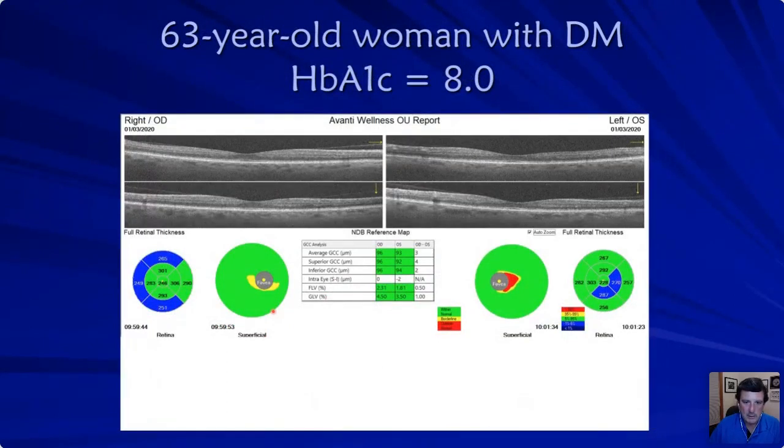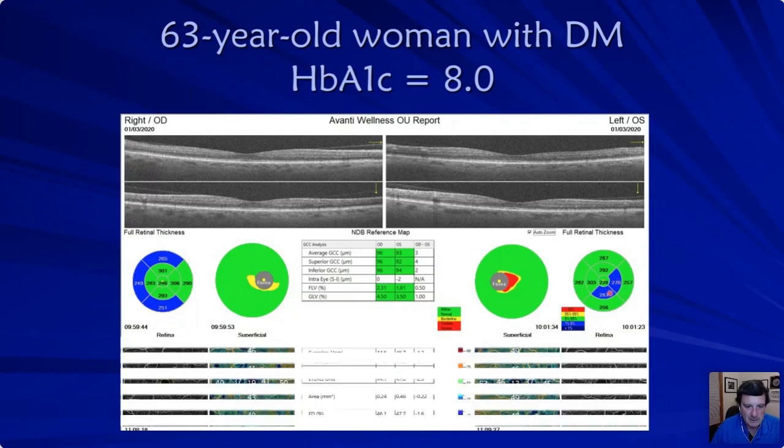And what we want to look at again is start here. Everything looks normal, nice and symmetric, 3, 4, 2, 0, 0. This looks healthy. I see a little hot spot right here or a little thin spot here, but nothing. It's kind of another little thin spot here. So nothing's really causing me any heartburn. I come over here and take a look. And again, we have thinning. These are thicker than average, but this is saying thinner here. So now let's take a look, I must have something hidden here.